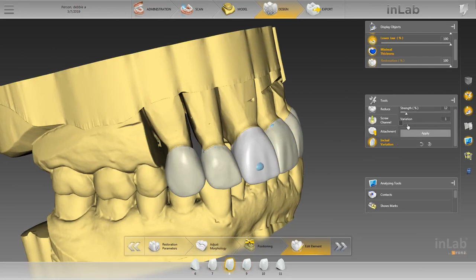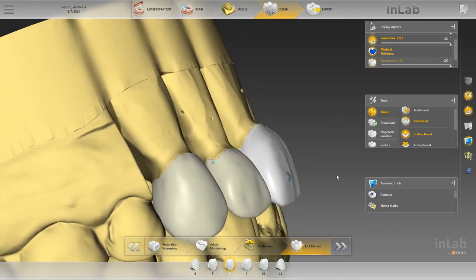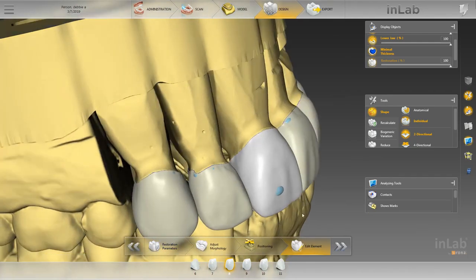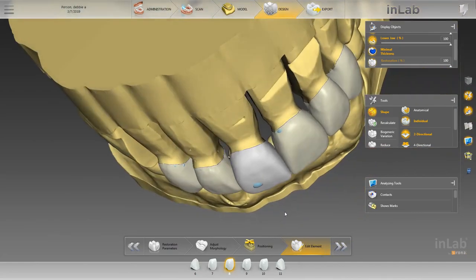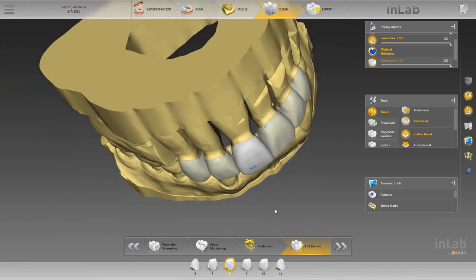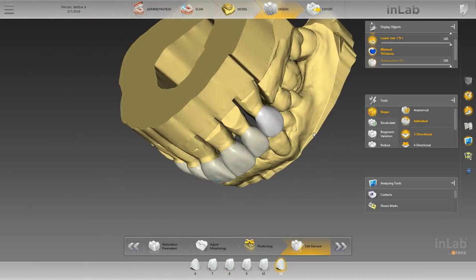We're at about 12. Number 2. That's good. And we're going to bring this one out just for this area of concern. And if anything, rather than leaving that flat and adding that slight little bump that we're doing for the thickness, that's as far as I'm going to go. It's giving it some more asymmetry. It's giving it some surface texture that you otherwise wouldn't have if they were just flat. So that's good. Centrals, laterals, completely done except for minor things.